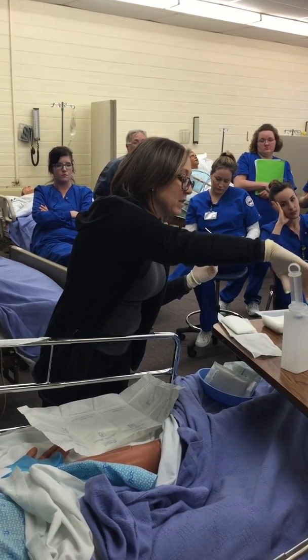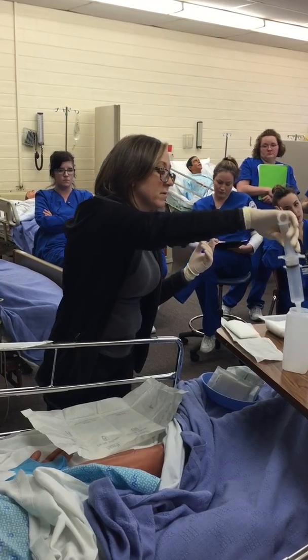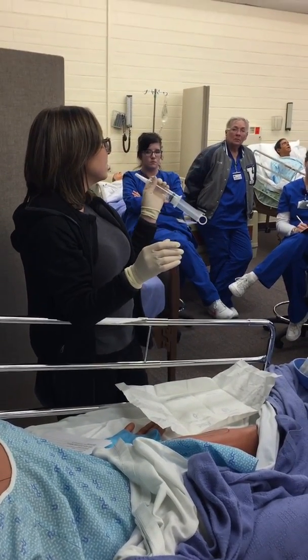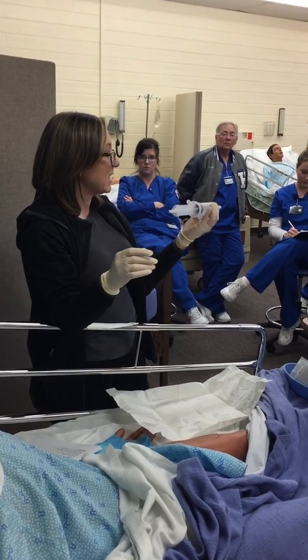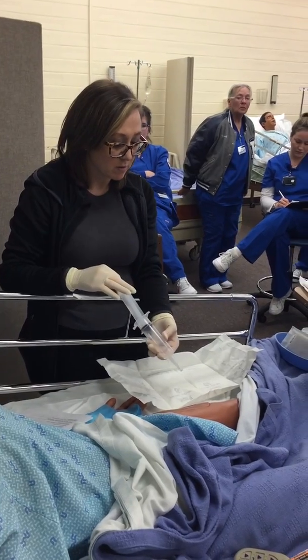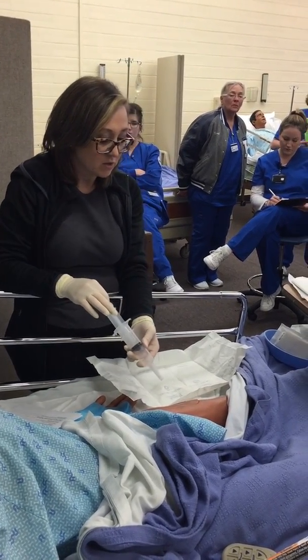Right now my hand's sterile, but you just don't want to go in there. That's all sterile. So I'm going to come straight out here. If I touch right here, is this sterile to sterile? Yes, because it was in there. So I can keep this hand sterile by touching here, and this hand here is not sterile anymore. So I'm going to go from center out and center out.